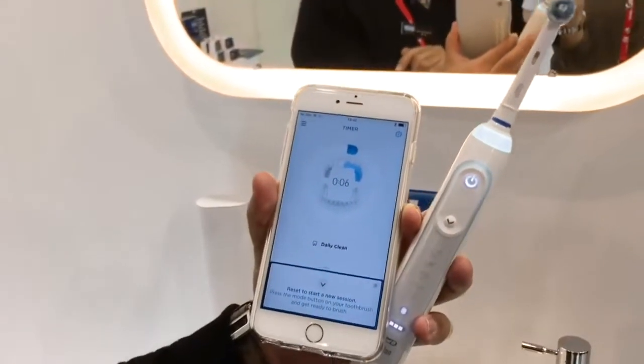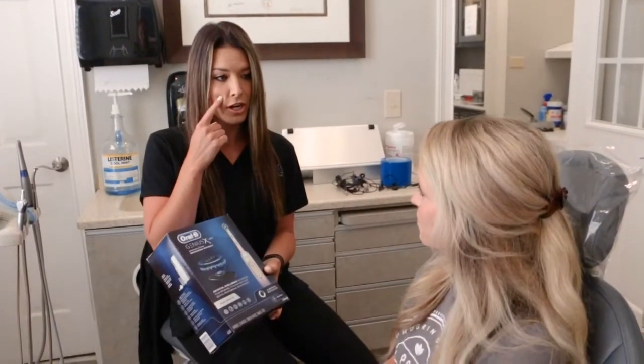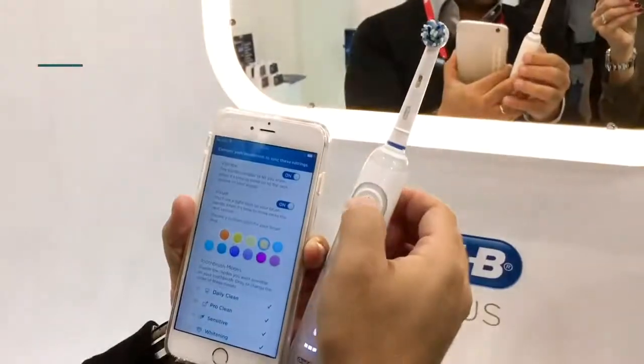It also has a timer on it. It stays on for two minutes — every 30 seconds it will beep at you, and then after the full two minutes it will shut off on its own.